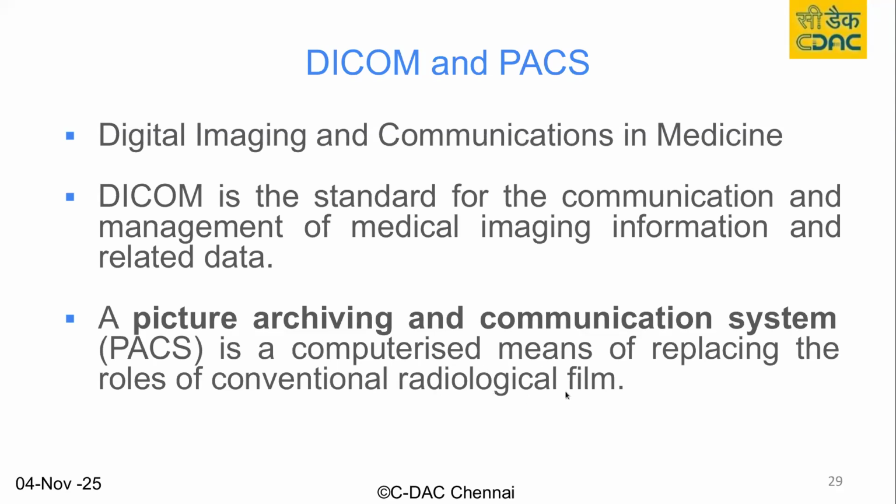So earlier we were actually using radiological films and their color changes when X-rays fall on them. So right now we have digital X-ray machines which will actually give you the X-ray image in your computer. So using picture archiving and communication systems software, you can actually view them in the computer itself. Earlier, if we were having these films, there were no medical digital images.